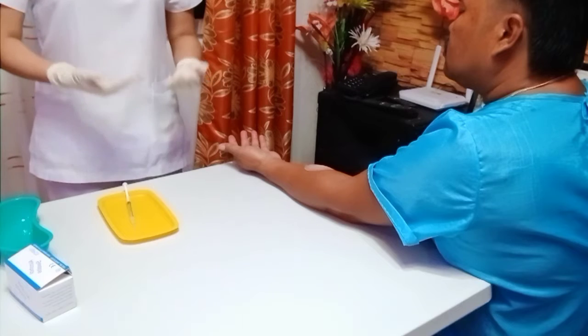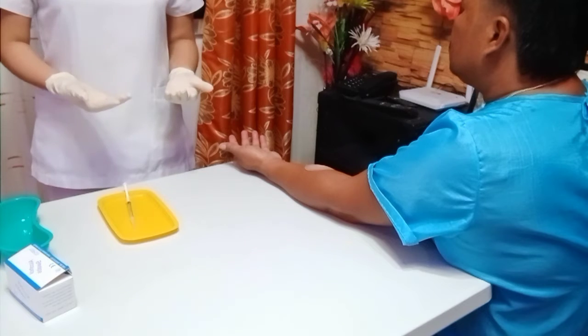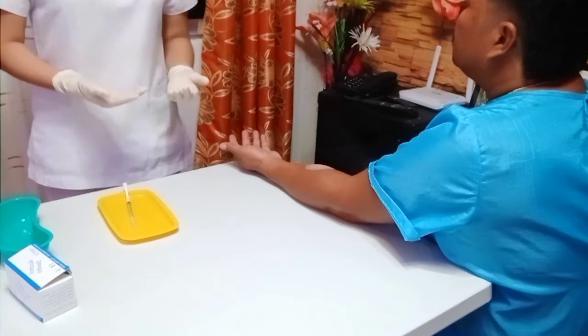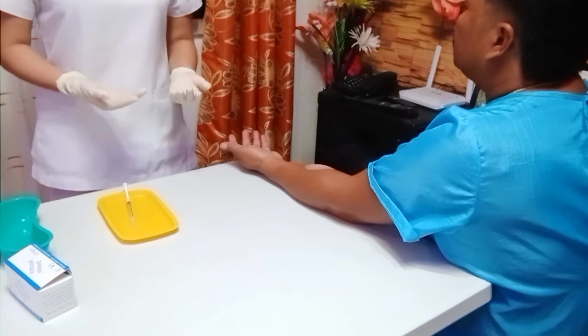This is done to prevent the transmission of harmful pathogens during the administration of healthcare. Next is to prepare the medication ampule for drug withdrawal, which I did earlier on a separate return demonstration video. This is done to save time and effort and to carry out tasks in a systematic manner.